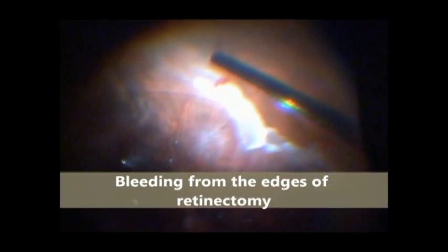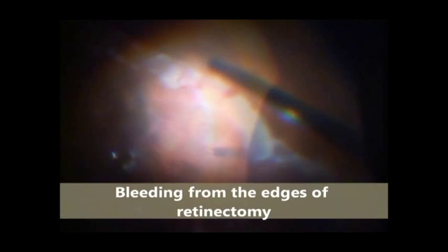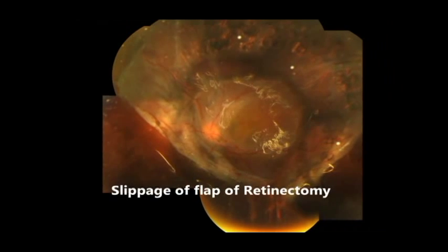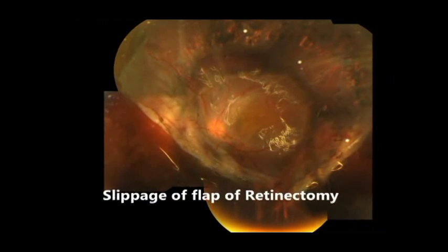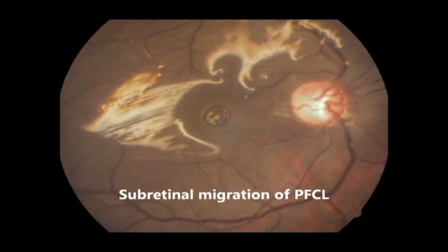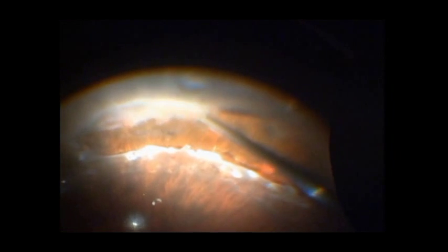The most common intraoperative complication while doing retinectomy is bleeding, and one must anticipate and prevent it. Postoperative complications such as slippage of edges of retinectomy margins and sub-retinal migration of PFCL can often be encountered. However, with due care, one can achieve satisfactory results in such complex cases.